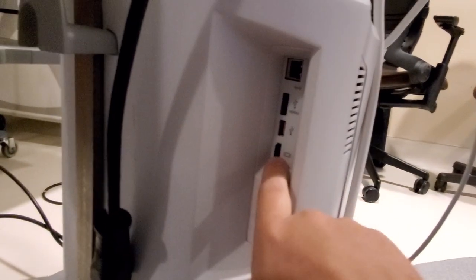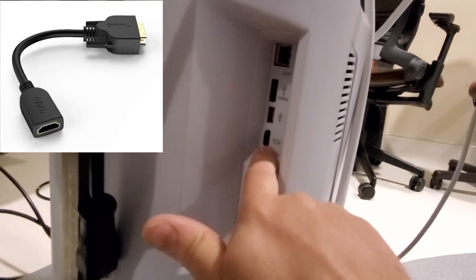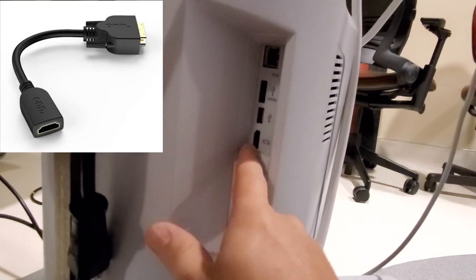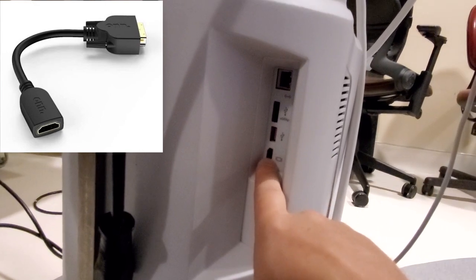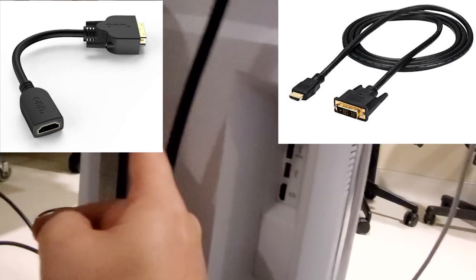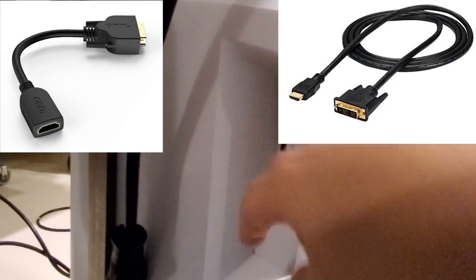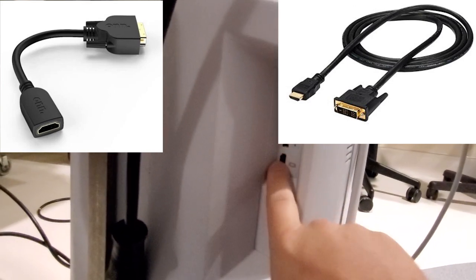Now, you can easily find 6-inch dongles, which are either a male to female or basically a cable extension, but they're only about 6 inches. And you're going to want to plug that guy into this device. And they have some of them that are like 3 feet long, which would be perfect because I would zip tie it right here. So the female dongle would be hanging right here. So they would be unplugging and plugging from the cable and not straight to the machine.